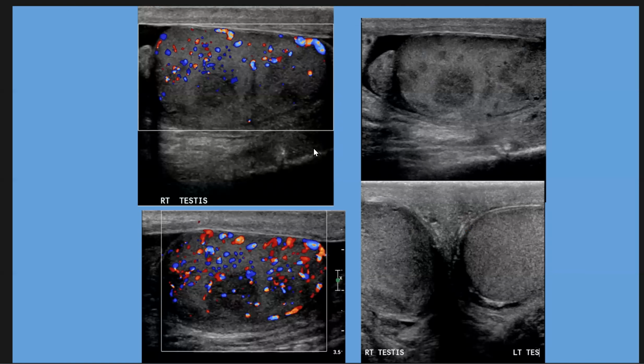Another patient with multiple abscesses, with orchitis.